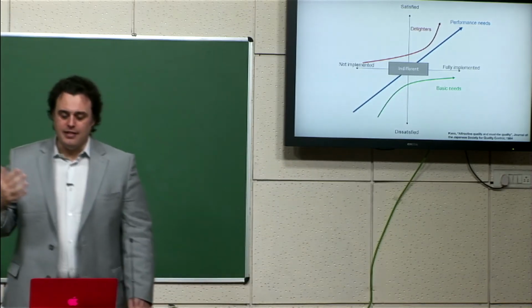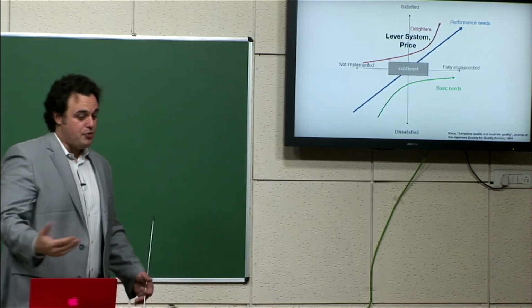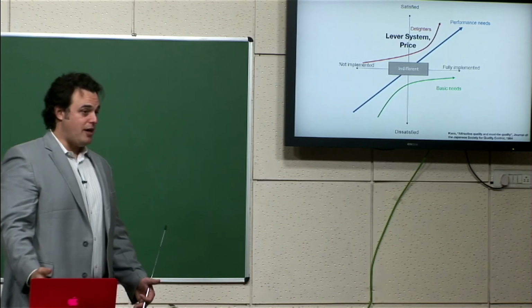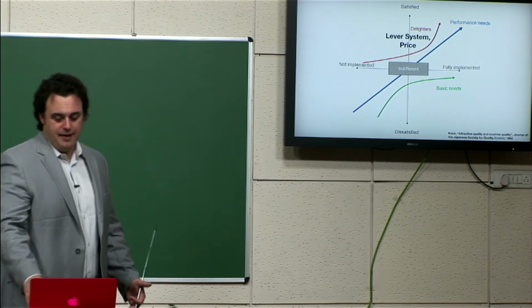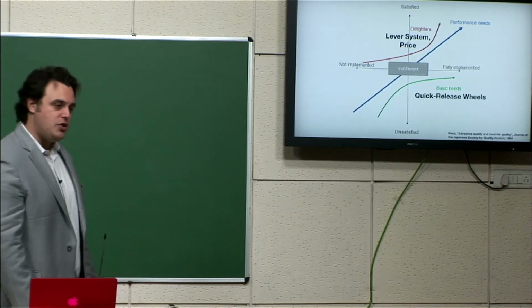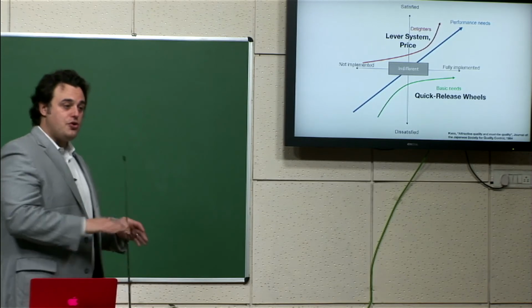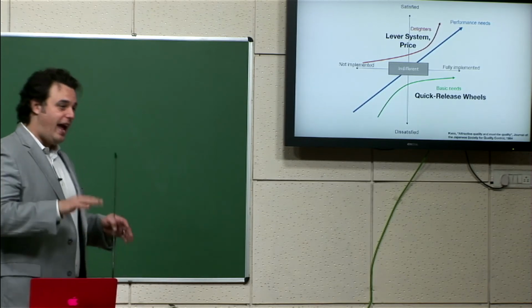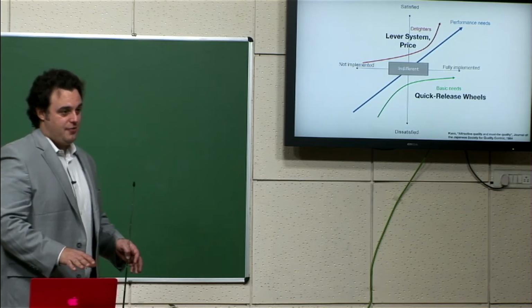So we had to think about this in terms of the LFC, because features like our lever system were really unique. And our price point. We had a very cheap product. That delighted people. They were excited about that. But things like the quick release wheels, so you could take the wheels off and put the chair in the boot of a car, those are standard features on a wheelchair. We had to do those. And if we hadn't, people would have been really dissatisfied, right?